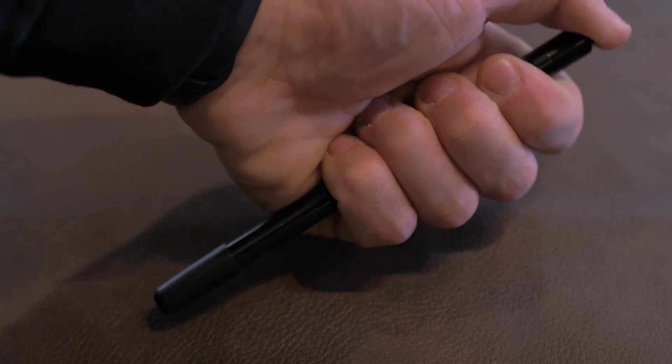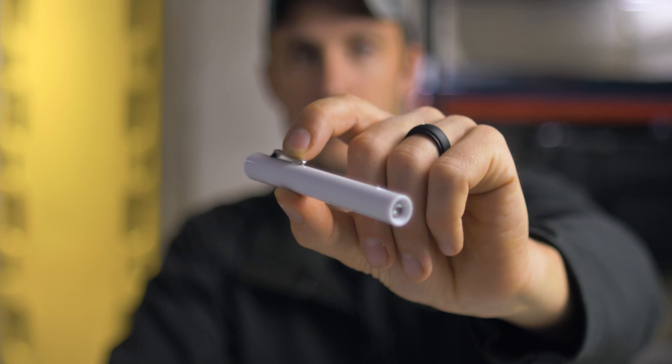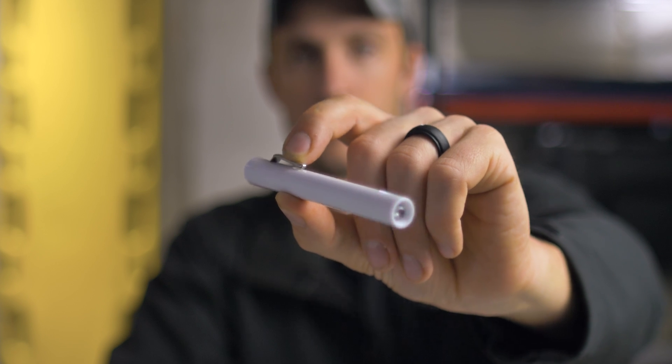The momentary switch on the back is a lot more durable than the cheap contact switch on the disposable pin lights. While the Streamlight stylus is a pricier option, Streamlight does offer a lifetime warranty on this flashlight.